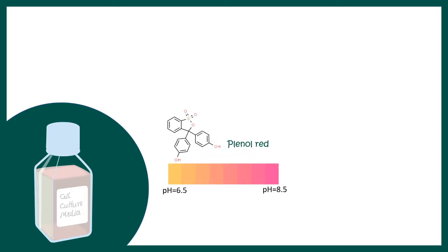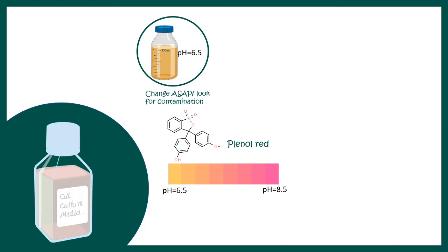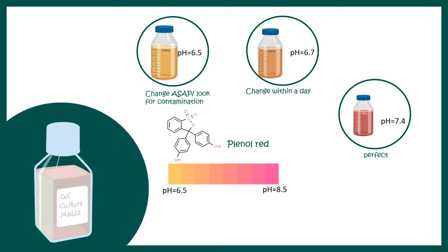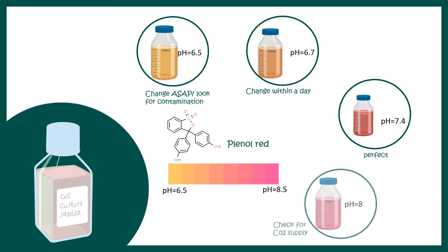Cell culture media also contains a pH indicator such as phenol red, which indicates a pH range of 6.5 to 8.5. At pH 6.5, the media turns yellowish, indicating it needs an immediate change or possible contamination. An orange color means it should be changed within a day. A deep red color indicates pH around 7.4, which is perfect. A pinkish color suggests CO2 concentration has been altered and the CO2 supply needs to be checked.